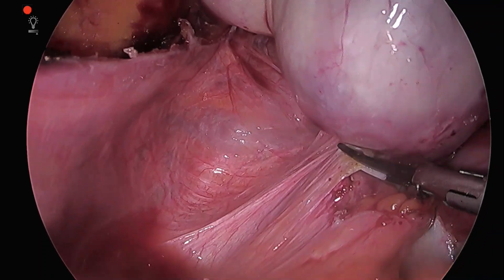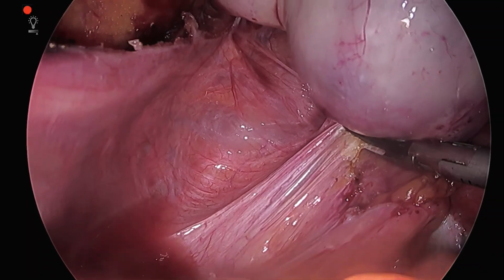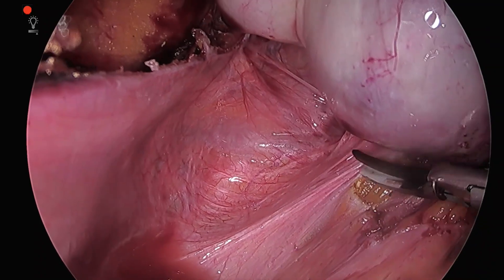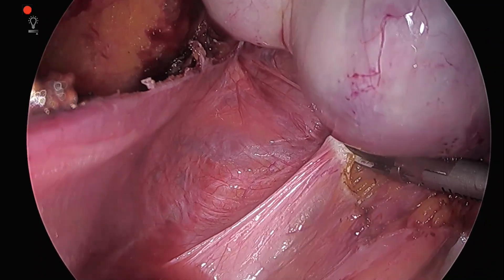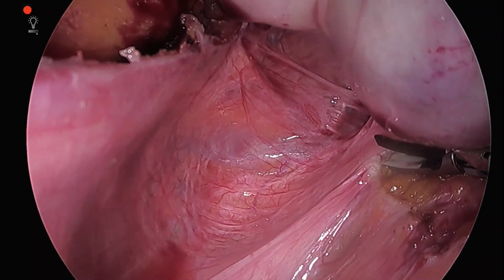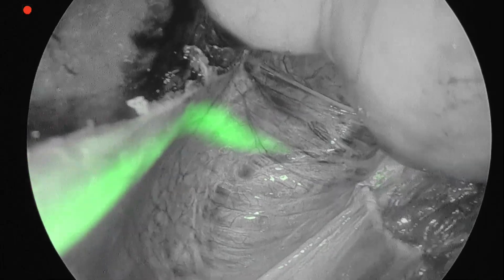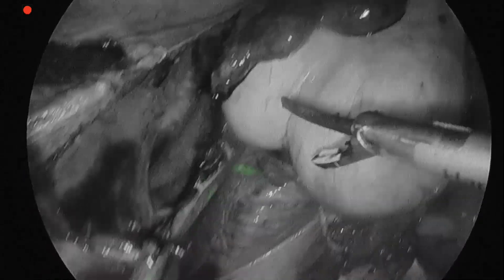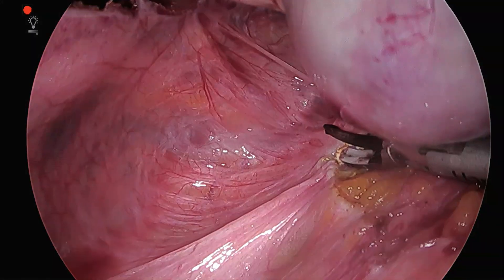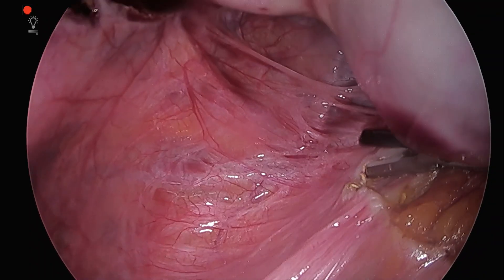There is mild tethering of the rectum to the ovarian cyst. The posterior attachments of the rectum to the ovarian cyst are being mobilized. If it is going to be difficult, the pararectal space will be developed. Since we are going close to the ureter, the ICG mode is kept on to see exactly where the ureter lies, which helps prevent ureter injury in difficult cases.